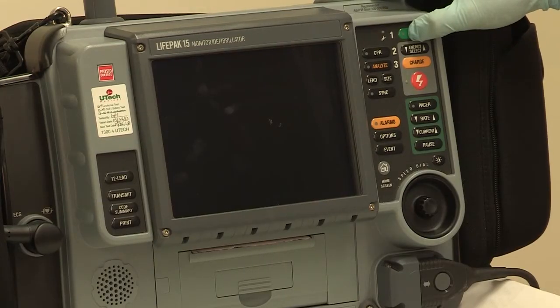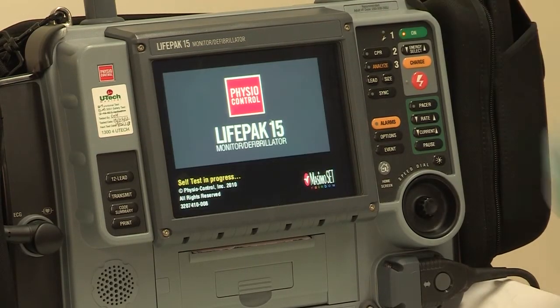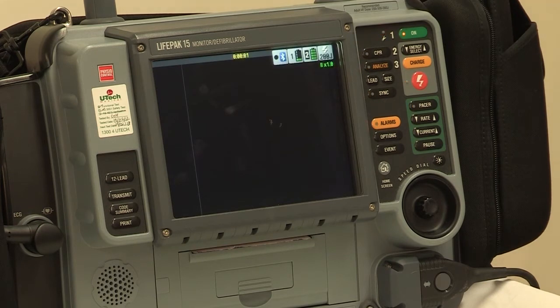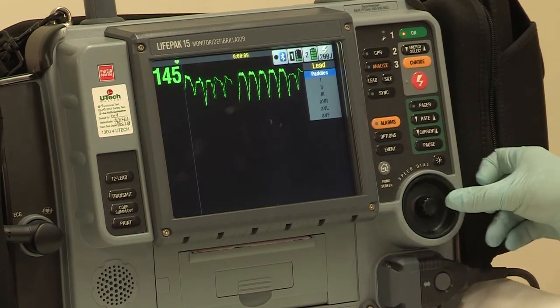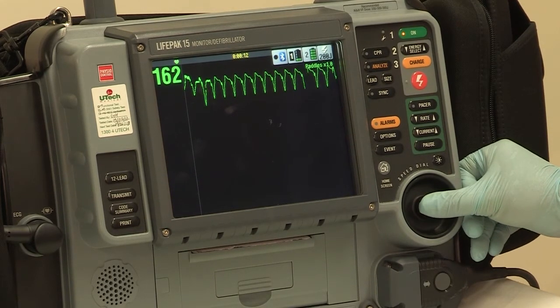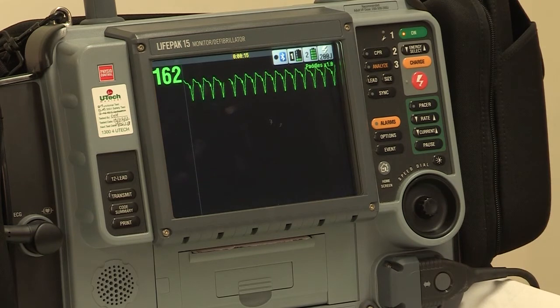Turn on the defibrillator. You can see the startup screen here for the LifePack 15. Push the lead button and use the black scroll button to highlight pads. Push the scroll button to confirm your choice. You will then see the rhythm displayed on the monitor. In this case, it is ventricular tachycardia.